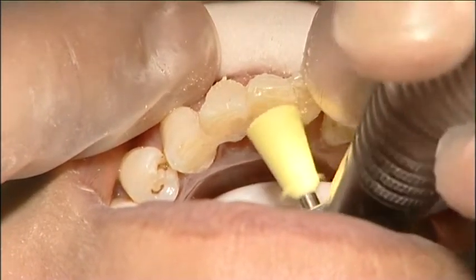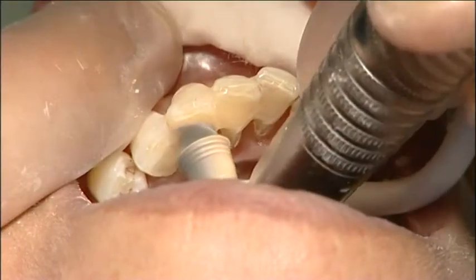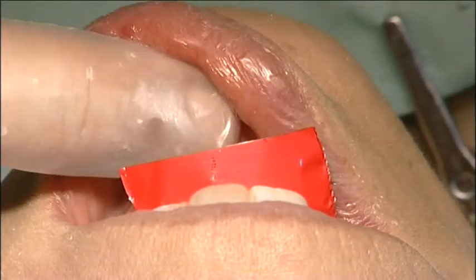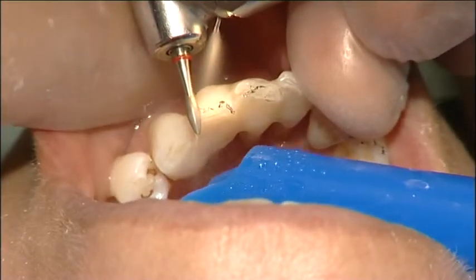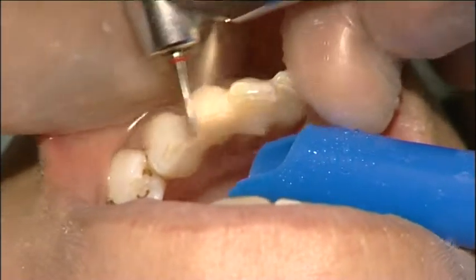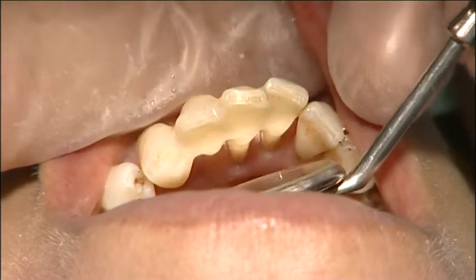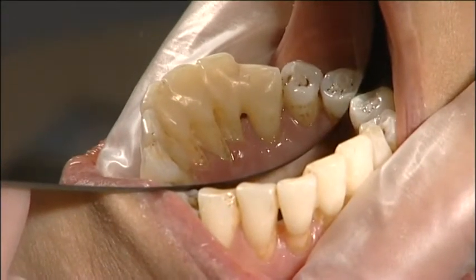The splint was polished and the occlusion was checked and adjusted. Both the patient and the dentist were very satisfied with the end result and its aesthetics. Now the highly mobile teeth are stabilised and the periodontal treatment can be continued.